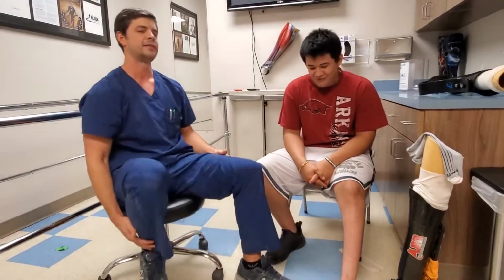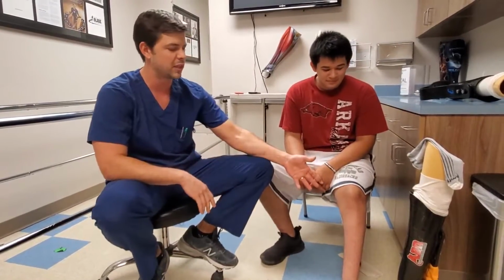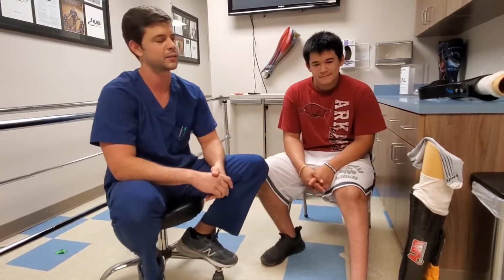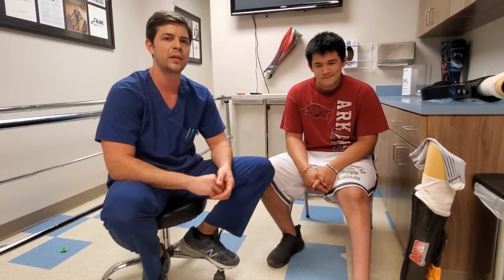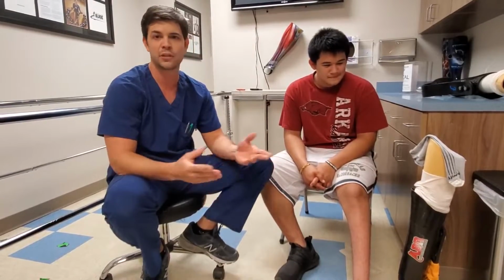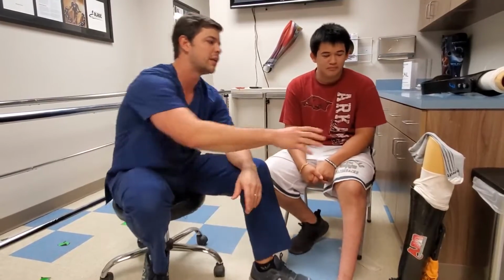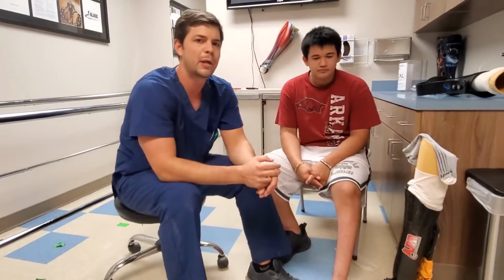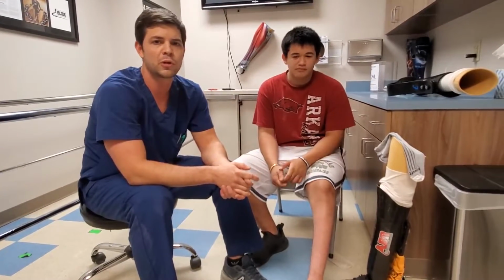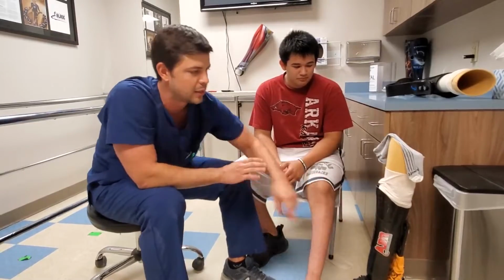And so if we can eliminate gel liners, that will preserve his skin, prevent athlete's foot and fungal infections, dermatitis, folliculitis, and also it minimizes sweat, and also it kind of frees up some funds that they can spend on other things like traveling to Nashville or something like that. So there's no maintenance required with a P-Light. His old P-Light lasted him, like I said, about 2 years when he saw Ryan Fan, and so that system was working great for him. Just the issue he had was he grew and he couldn't fit in his socket anymore.